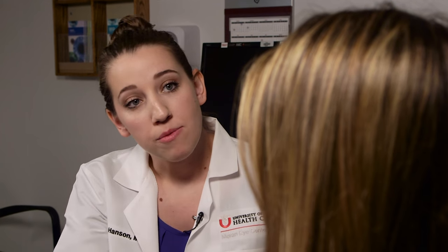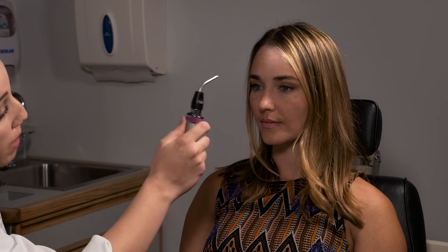You're going to start out by asking the patient to focus on something in the distance. You're going to use the muscle light to shine into each eye. Then you do the swinging light test where you go back and forth between the two pupils. An afferent pupillary defect is present if the pupil dilates when the light reaches it again in the swinging light test.